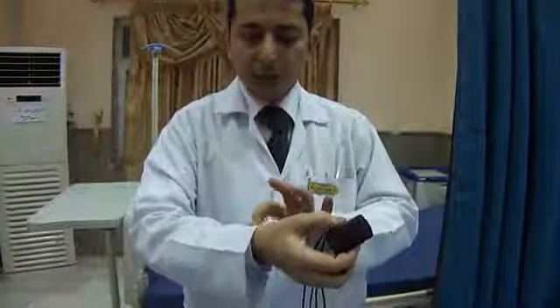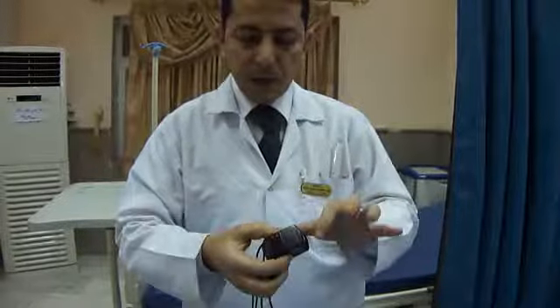The third and last issue is a patient with a very high white blood cell count, with immature cells. Those patients will have a normal saturation of oxygen, while the oxygen tension inside their blood will be low. In this state, the saturation of oxygen via pulse oximeter will be more accurate than the blood gas because of the consumption of the oxygen.